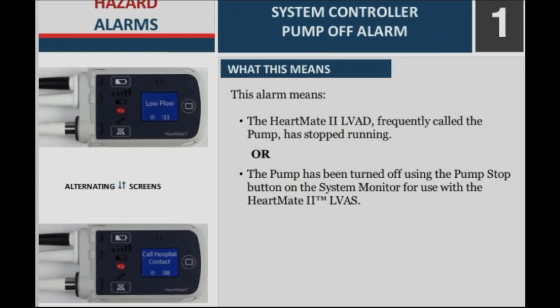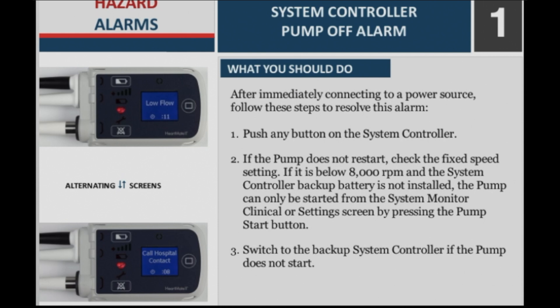What this means: The HeartMate II LVAD, frequently called the pump, has stopped running. Or, the pump has been turned off using the pump stop button on the system monitor for use with the HeartMate II LVAD. What you should do: After immediately connecting to a power source, follow these steps to resolve this alarm.